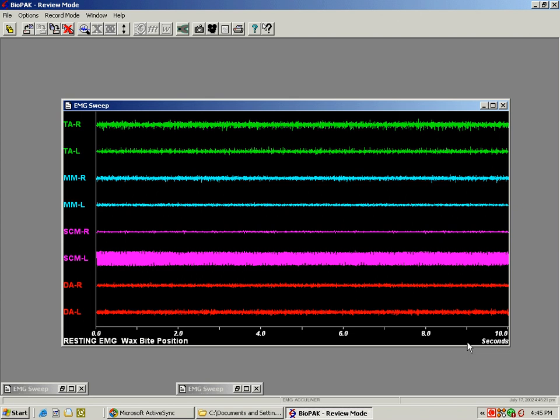When reviewing electromyographic resting activity, the first thing that we'll see is the sweep that was taken with eight muscles active.